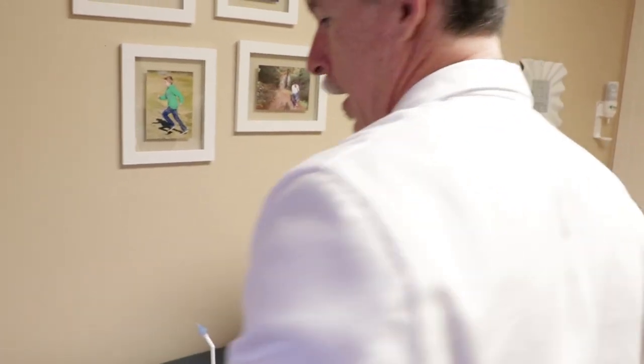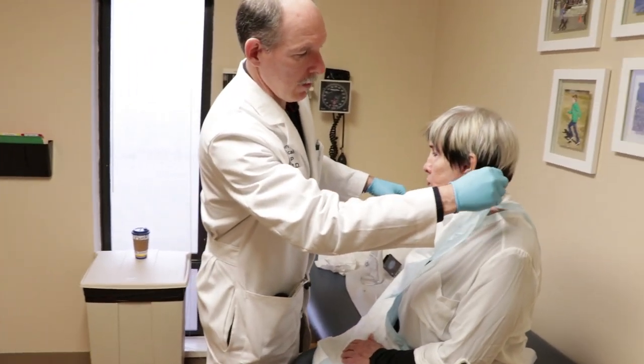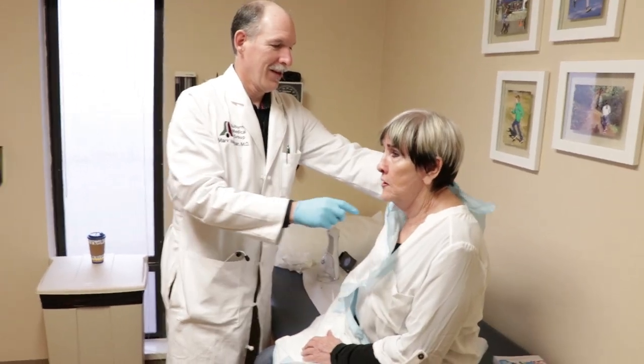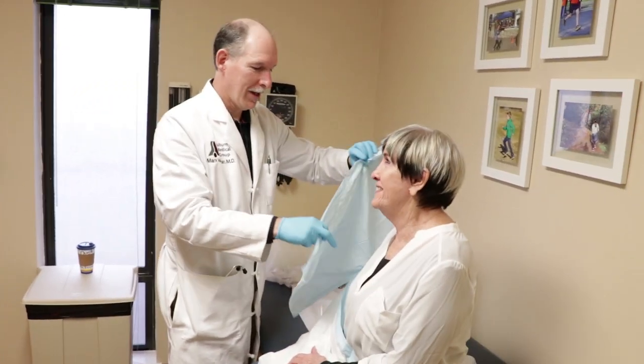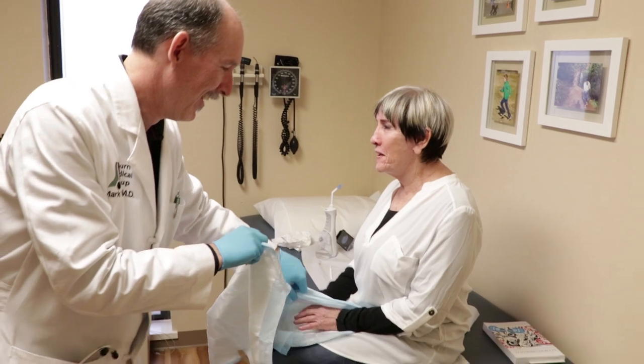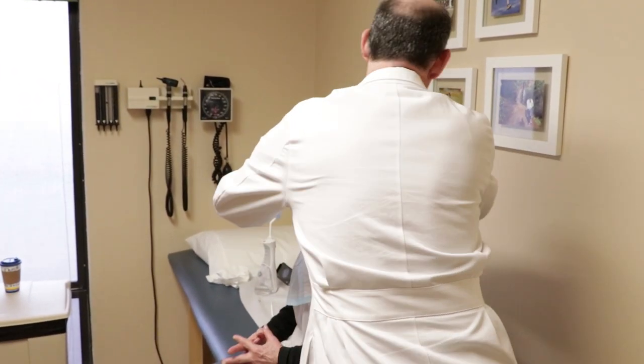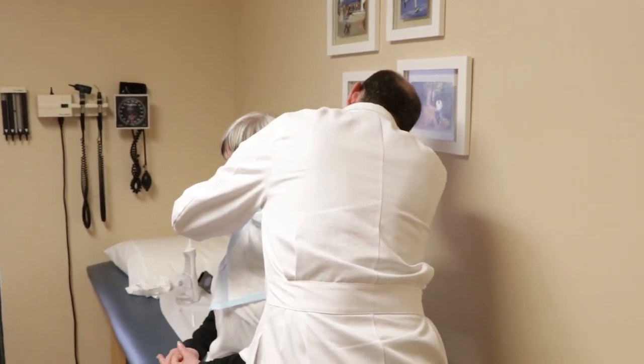Moving on to the left ear. I was in Costa Rica — I lived there for eight years — and I went to see an ear doctor for the same thing. When she saw the eardrum she sang to it. You did not sing. Oh, I'm sorry. Is it too late? She worked primarily with children. But it was delightful — I never had anybody sing to my eardrum before.